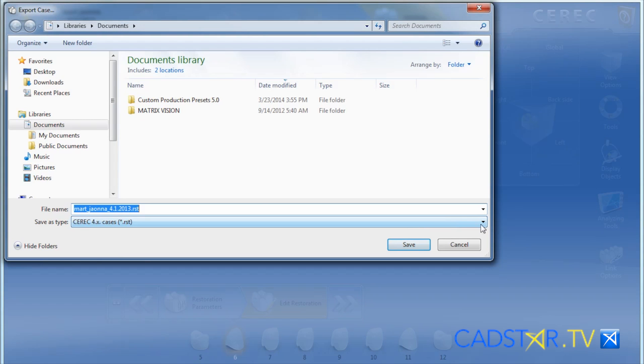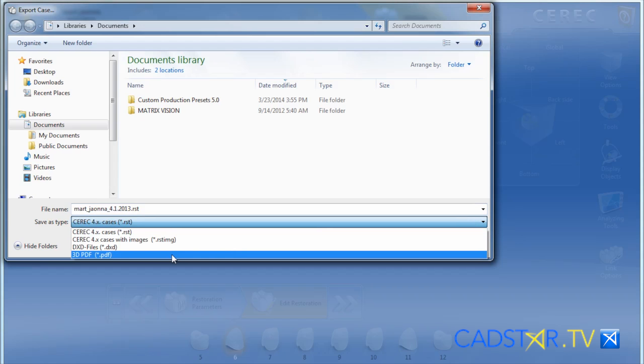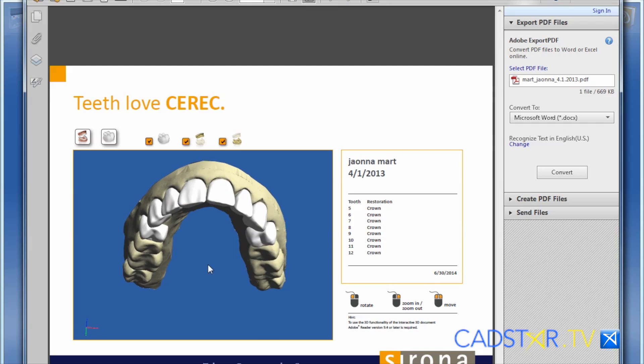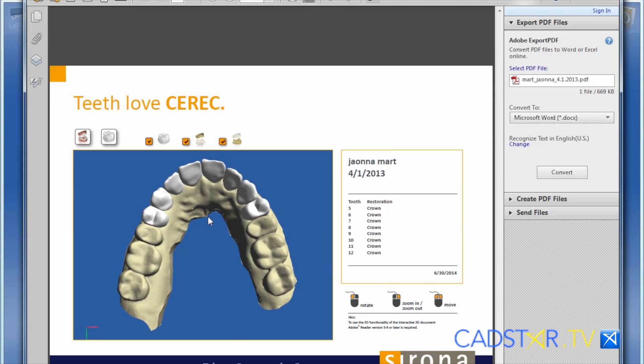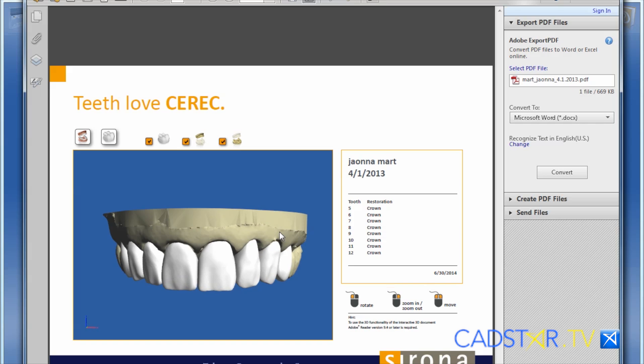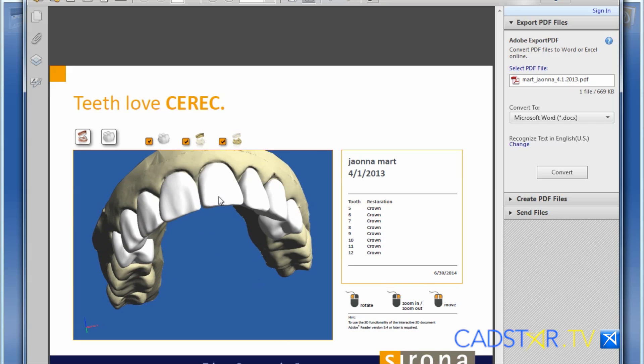Another feature is 3D PDF. You can take a case and make a 3D PDF. Some people will use it for communicating to a lab, or you can send it to insurance. It's a nice development.